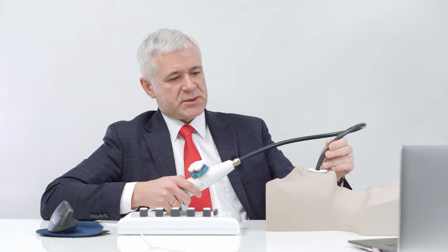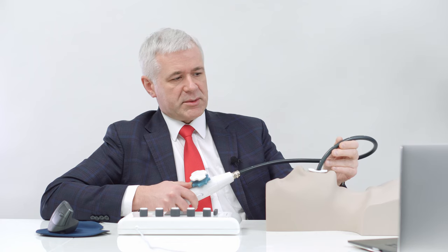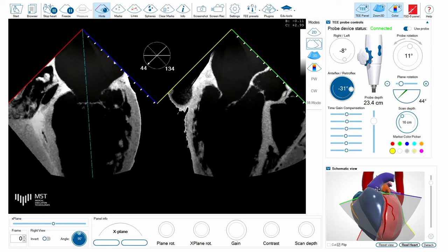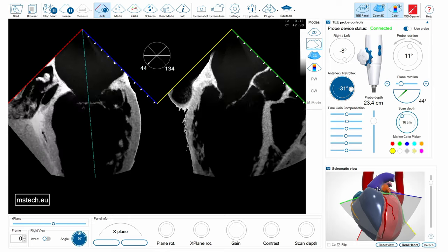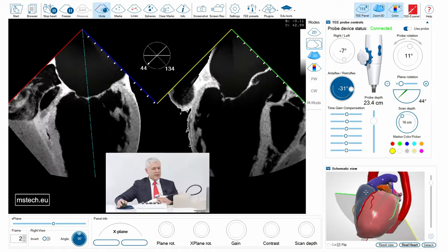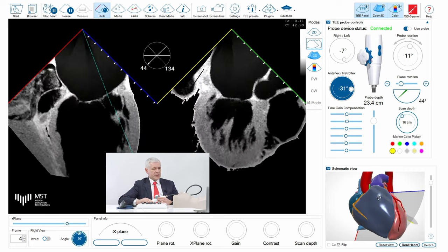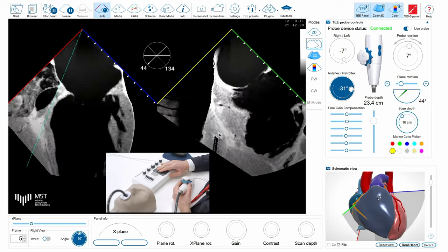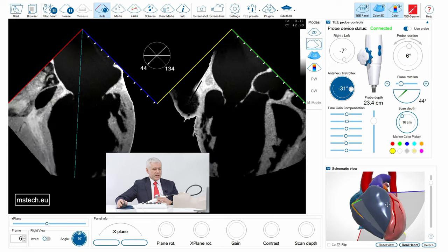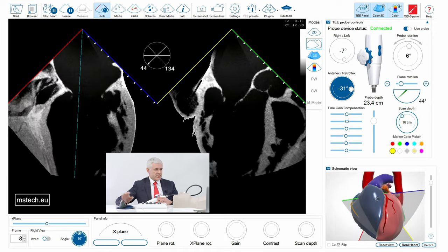I can also use the so-called X-Plane mode of this simulator — similar to contemporary 3D echo machines — to see two perpendicular planes, which are now marked with the blue and red colors as we saw before, and the yellow and green seen as a perpendicular plane here. I can manipulate the angle of the secondary plane with the trackball as in a regular echo machine. So you can easily check the position, the angle, and all the anatomical aspects of the simulated echo.